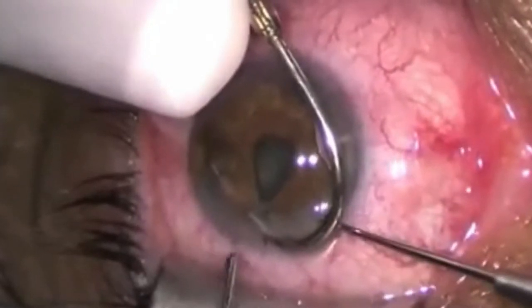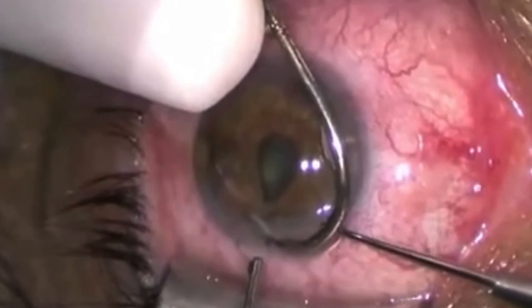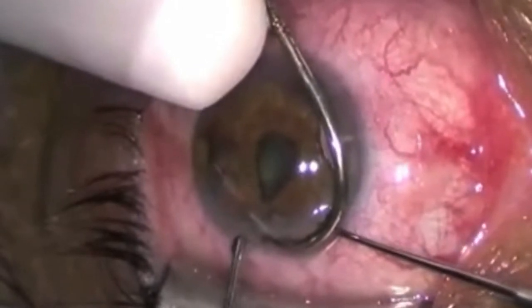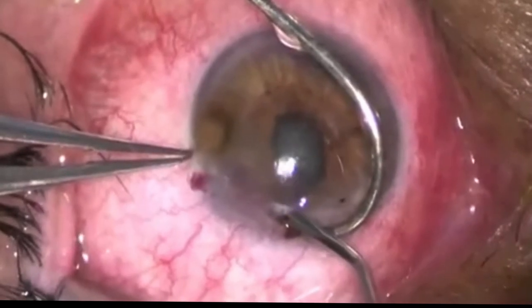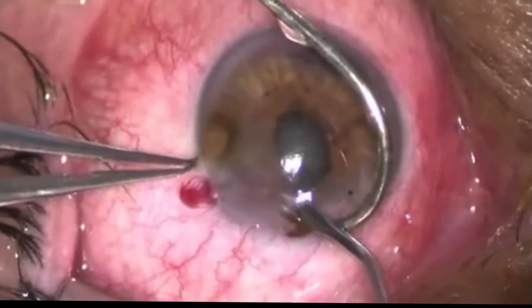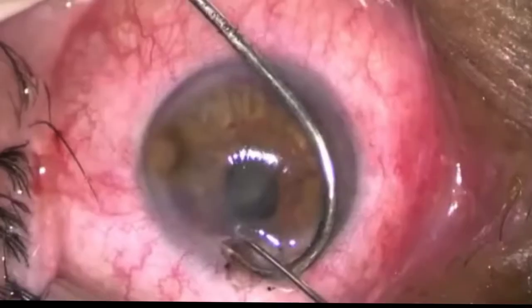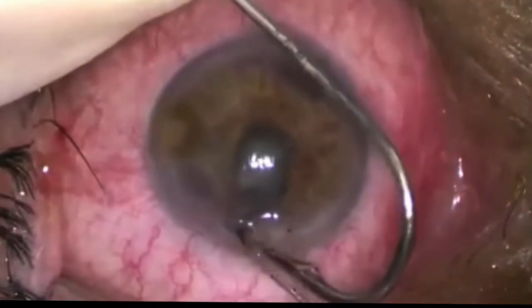There's a lot of boring footage of me attempting to remove the hook from the iris, and we'll just skip straight over that and pretend like all of this happened really quickly. I managed to spare at least a good bit of that iris, and we realized we would have to open the wound to remove the hook because of its barbed shape. Once the wound was enlarged, the hook was able to slide out pretty easily.